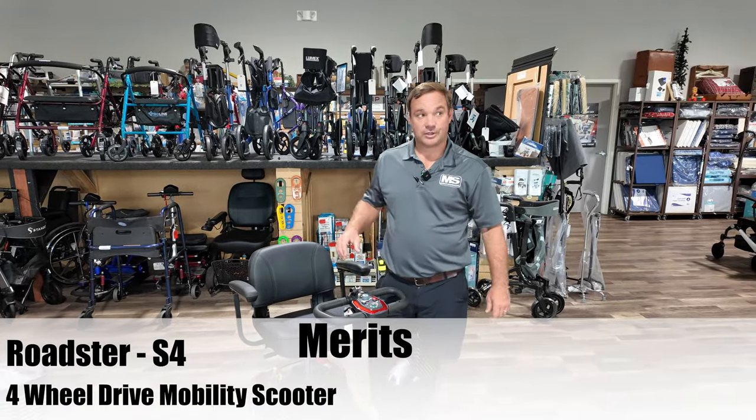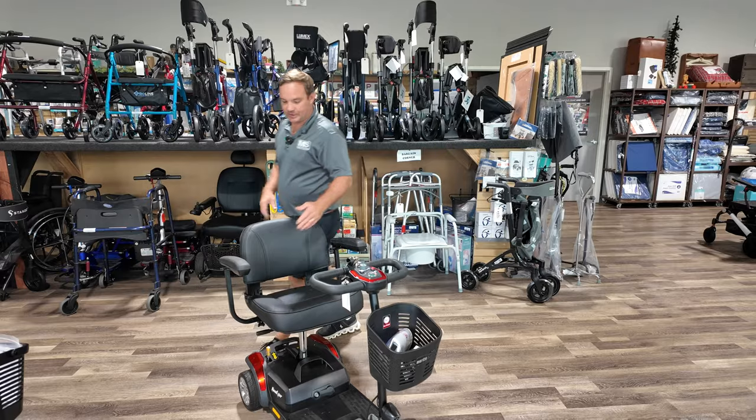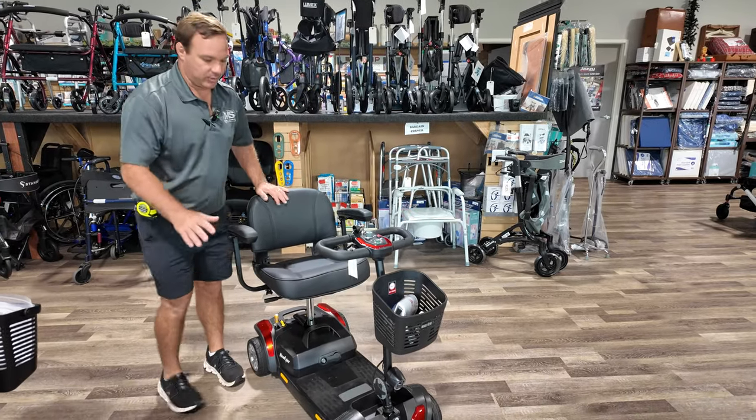I have a Merritt Roadster S4. It's a four-wheel scooter. They also have this in three wheels. It comes in red or blue.